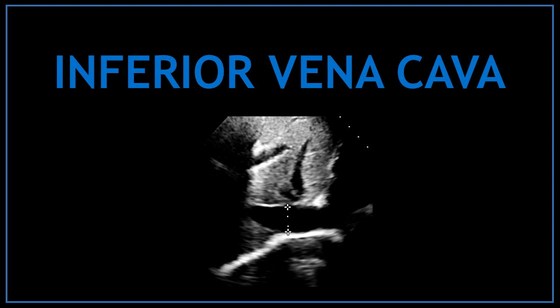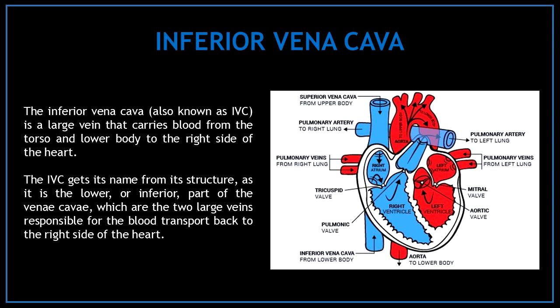So let's start. First, let's start with the basics. What is the inferior vena cava?